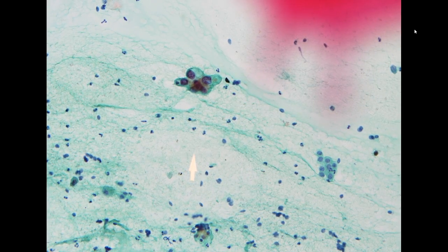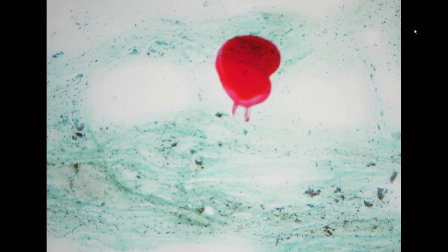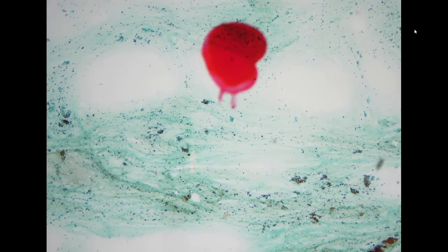The cellularity of the atypical cells is not plentiful. They were just very scattered along this direction and not accompanied by any extracellular material. So in this situation, it's a little bit difficult to determine where this is coming from. It doesn't look like direct sampling from the cervix.